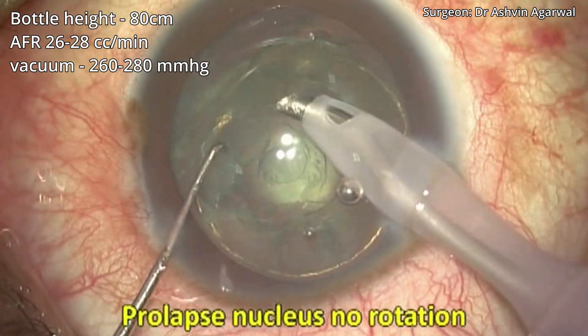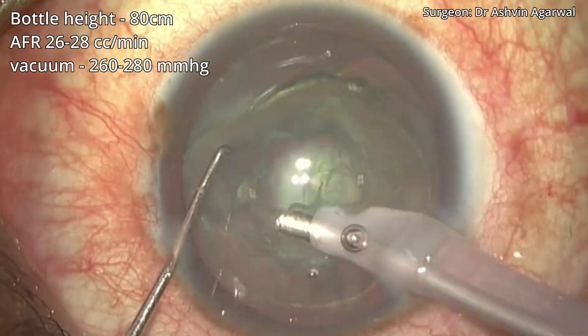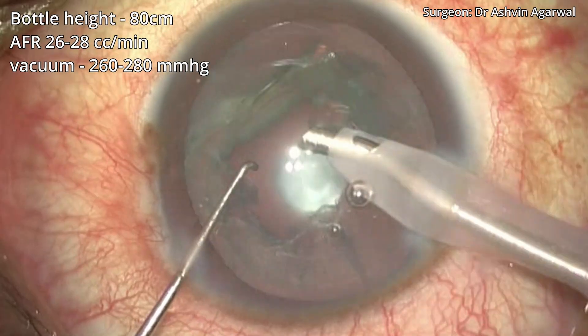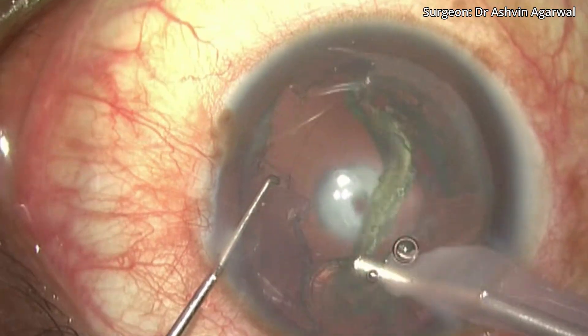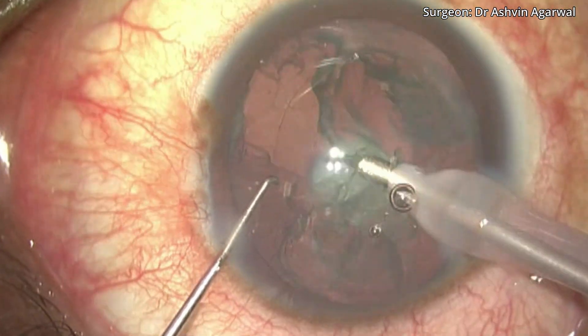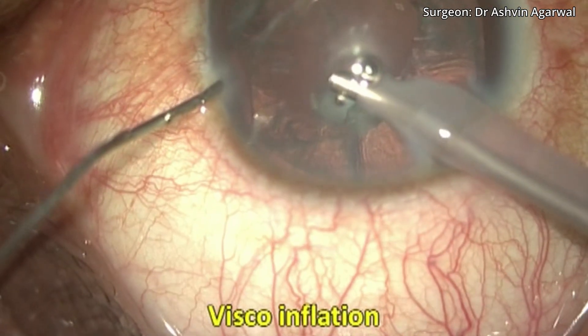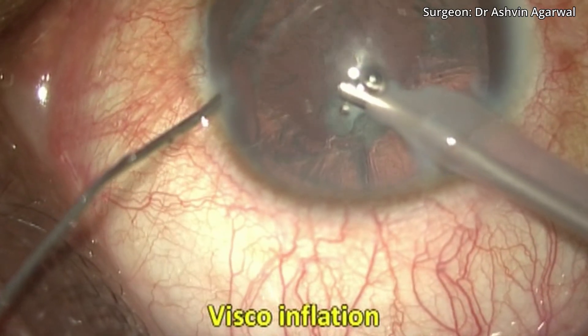Then we proceed with phaco under low flow settings. The nucleus should be emulsified before manipulating the PPC component, which prevents nucleus drop or cortex drop in case of a PCR.